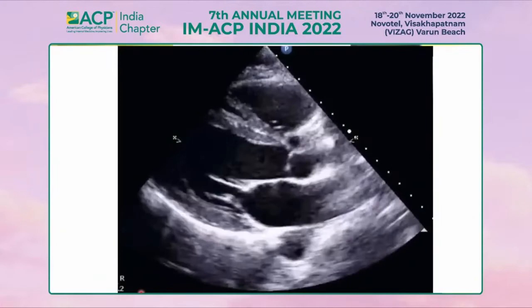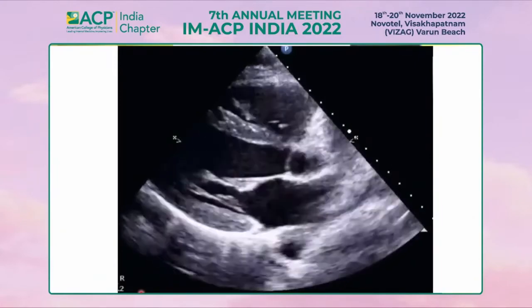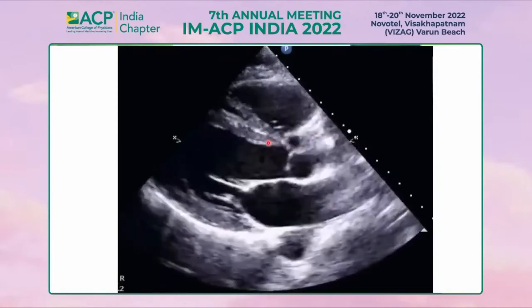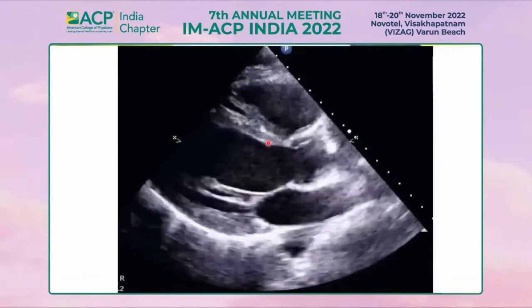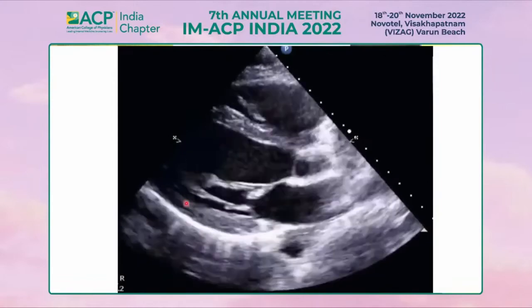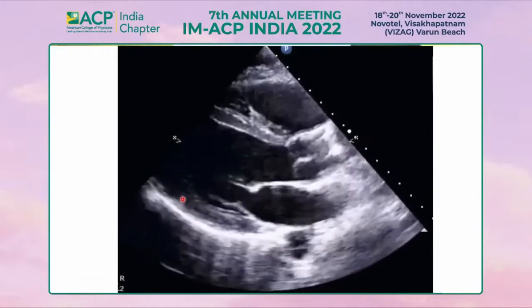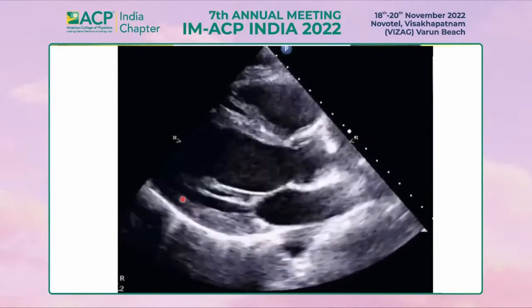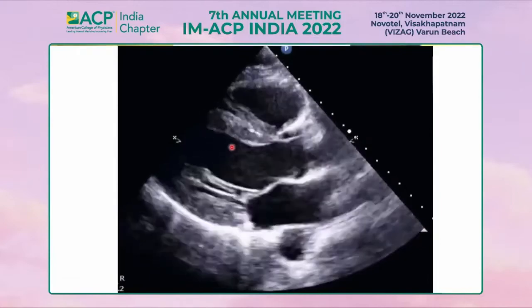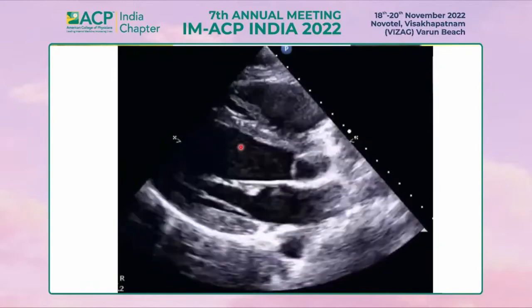How about the contractility of this case? First, all endocardium uniformly contracts inward. Second, myocardium thickens more than 40% in systole. Third, the anterior leaflet of the mitral valve gets closer to the septum, until less than 1 cm in diastole. So, this case is normal contractility.